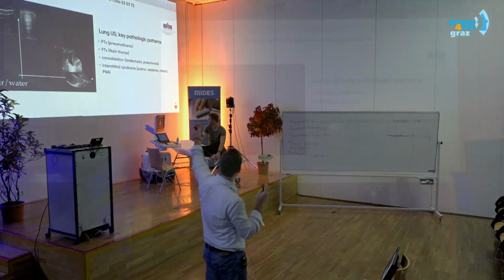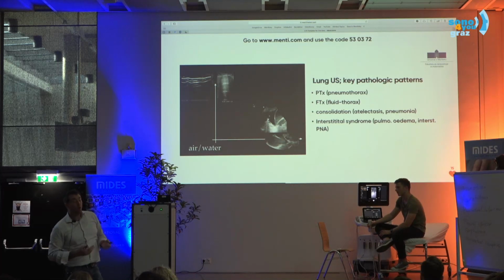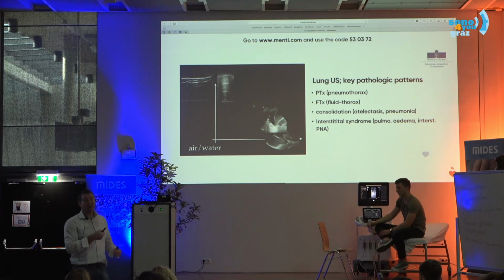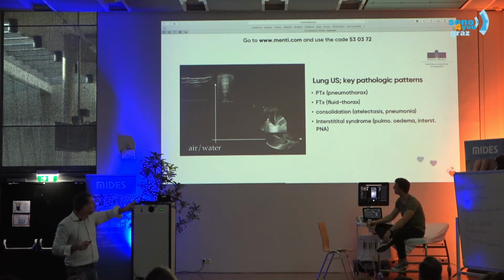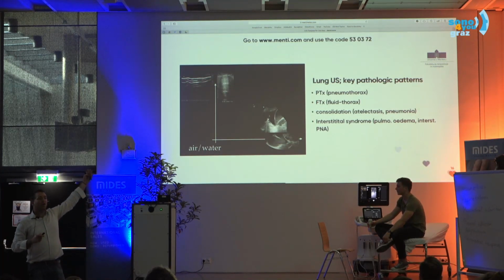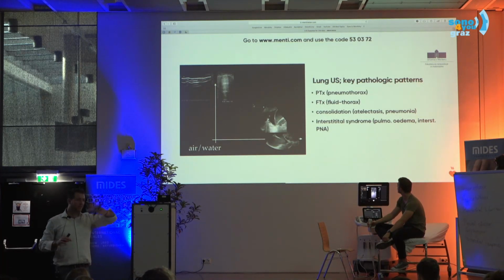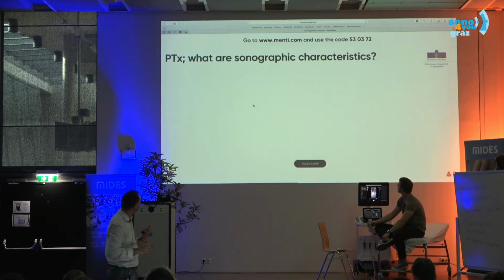And that can be pulmonary edema, interstitial pneumonia, or actually it can also be one good whack with lung contusion. It will also cause edema, and it will be seen very similarly to interstitial syndrome. So please remember, next to the fifth one, which is the normal finding, these are the 4 basic pathologic patterns of all the different diseases of the lung or pleural cavity.